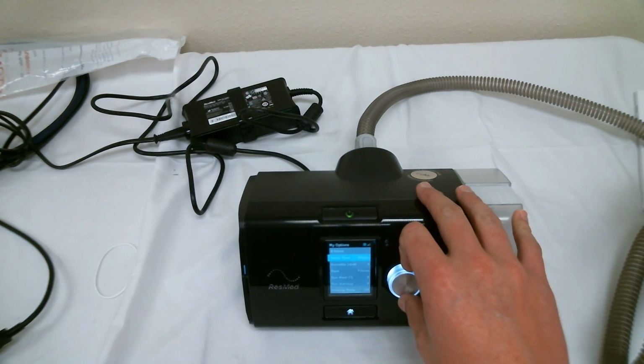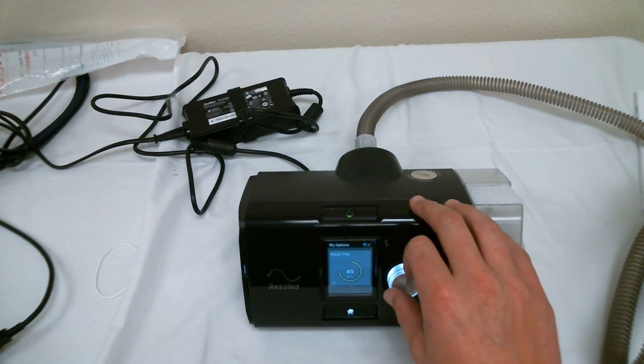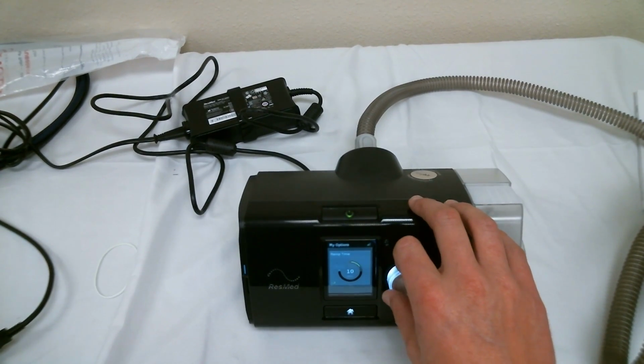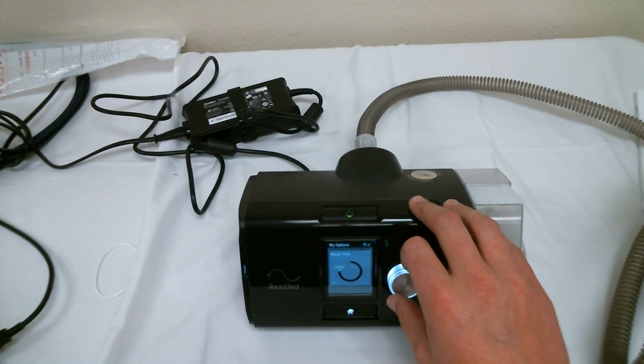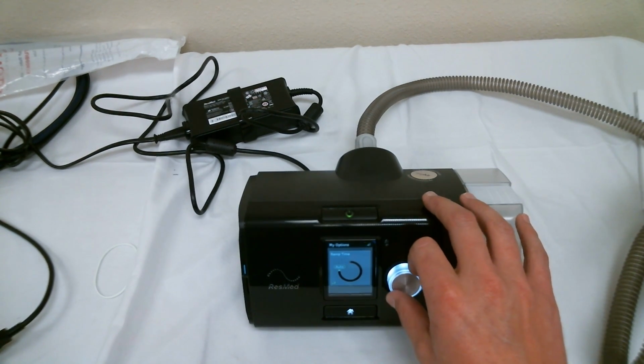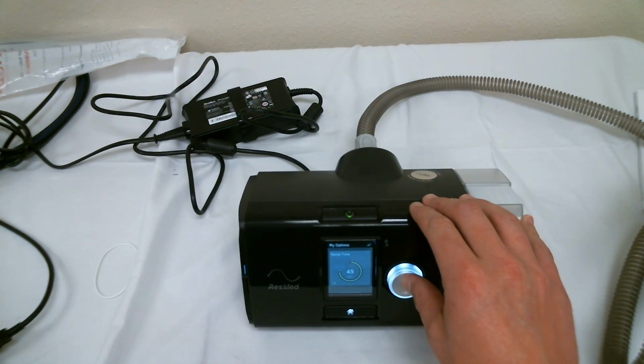The first option you have is the control of your ramp time. Ramp time is the amount of time the device will take to gradually increase the pressure to your prescribed amount. This is a comfort feature that allows you to fall asleep easier with minimal pressure. It ranges from off to a maximum of 45 and even includes an auto ramp feature. The auto ramp feature allows the machine to monitor your breath rate, detecting when you fall asleep and automatically increasing the pressure at that point. Once you've made your selection, press to confirm.